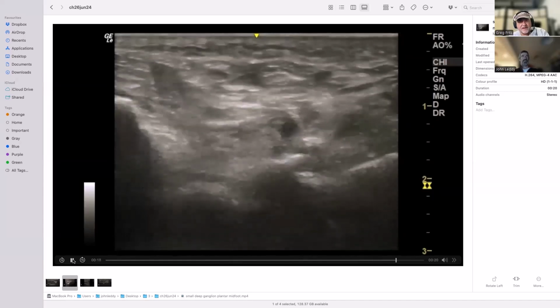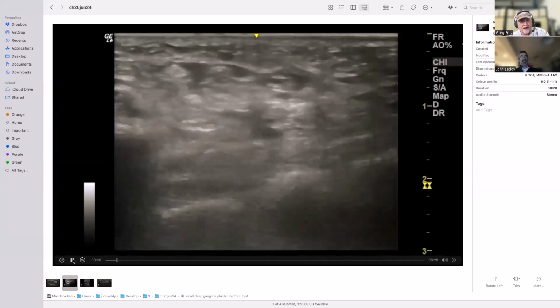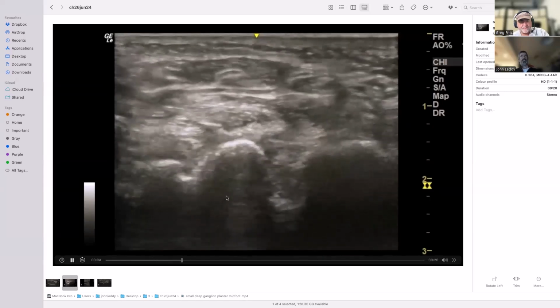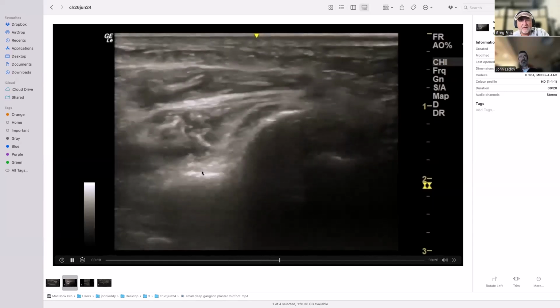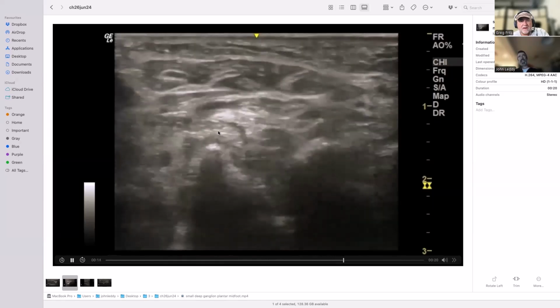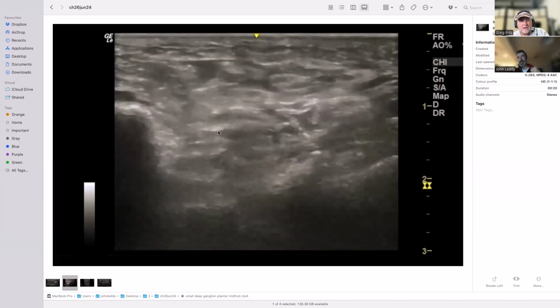I don't really usually spend very much time looking at the plantar aspect of the tarsals and tarsometatarsal joints. But what made you think of it? I'm trying to think. How close are we there to the Henry? Is that on the other side? A little way from the Henry. This is more on the lateral side and more distal. Do you scan peroneus longus in the plantar foot?